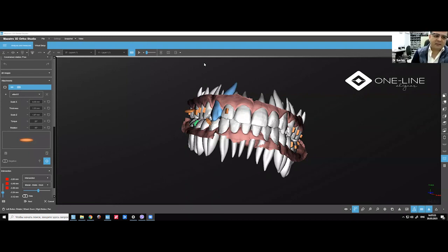No, nothing. Okay. How do you remove it after suck down? Yeah, okay. We can remove it very easily, the way you normally remove other attachments. There's no problem at all. You can see that this model which I showed you was already after the suck down, and the attachment didn't come off. It also depends on your resin, because if your resin is good, then you won't have this problem.